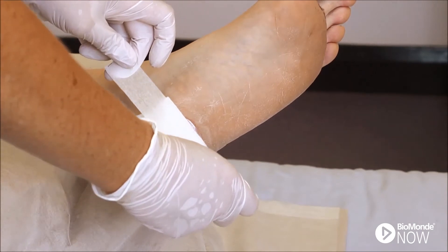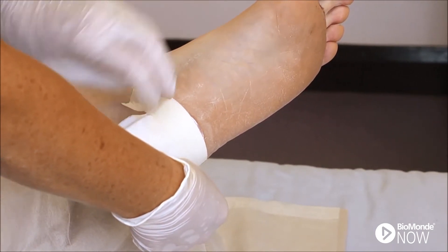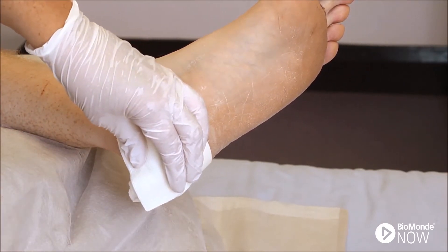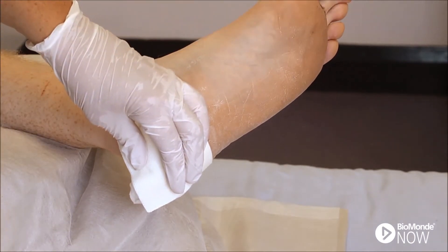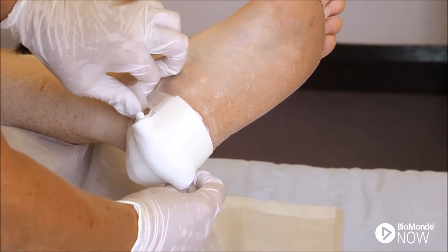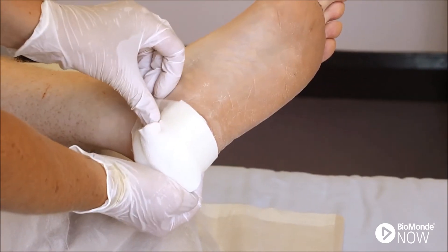Place the moistened gauze over the top of the bagged larvae. Put an absorbent wound pad on top and fasten in place using gauze tape. Only permeable and non-occlusive dressings can be used. Occlusive or potentially occlusive dressings such as super absorbent wound pads or foam dressings cannot be used.